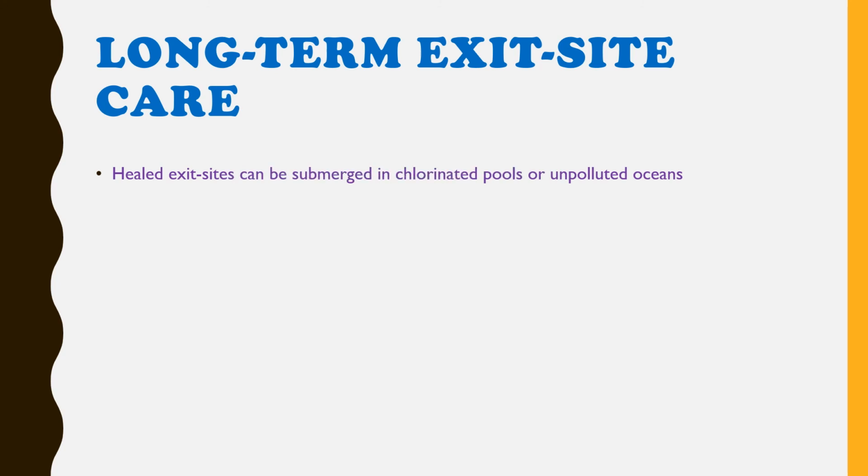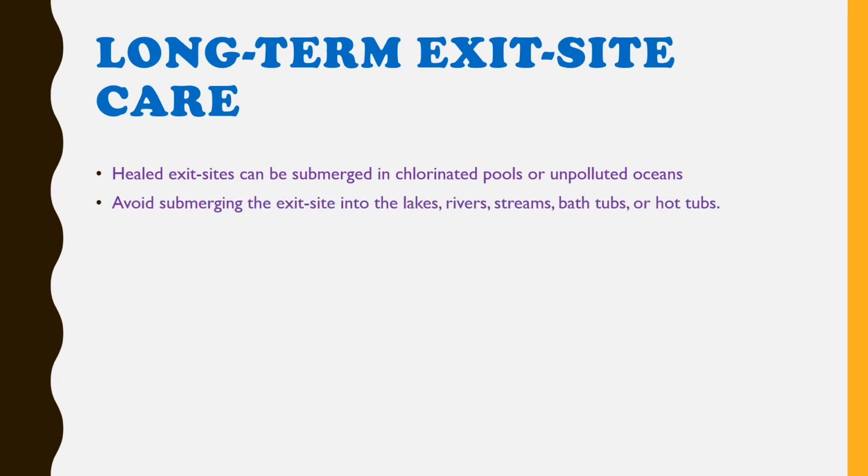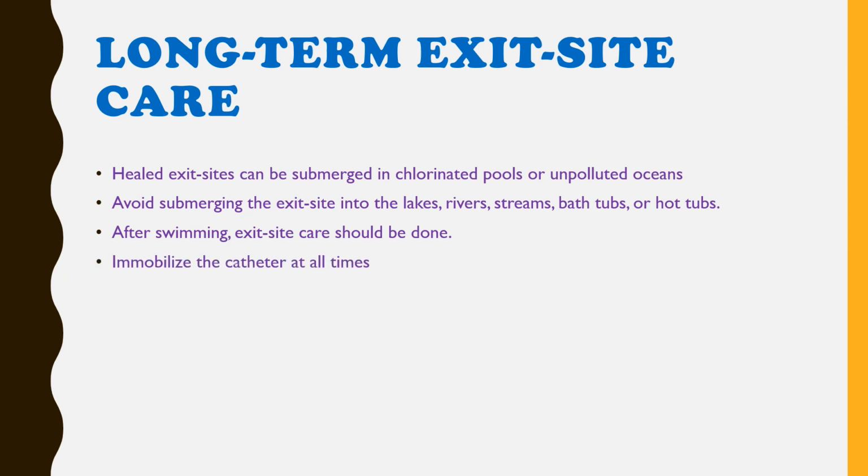Healed exit sites can be submerged in chlorinated pools or unpolluted oceans. Avoid submerging the exit site into the lakes, rivers, streams, bathtubs, or hot tubs. After swimming, exit site care should be done. Immobilize the catheter at all times. Non-sterile dressings can be used.